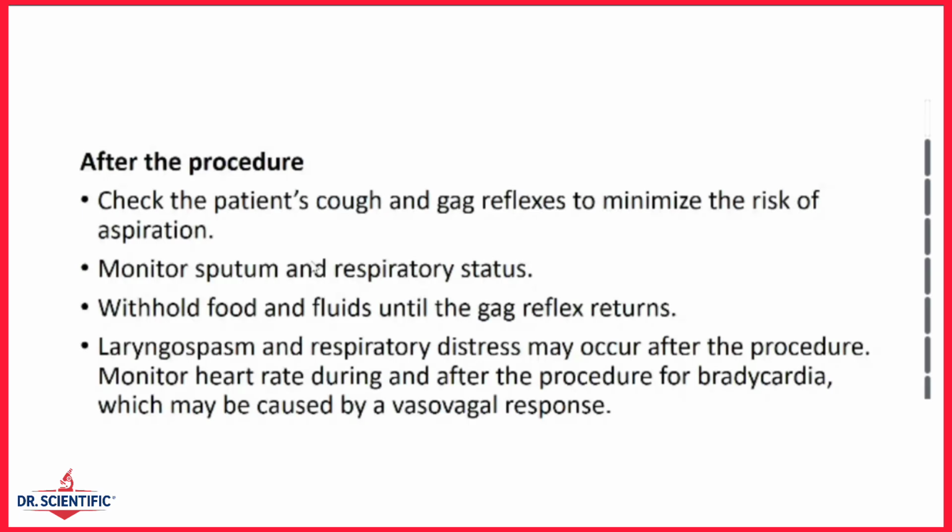Then after the procedure, still maintain the patient nothing by mouth, so no foods, no fluids, until such a time that the gag reflex returns. Usually the gag reflex will return after about 1 to 2 hours after the procedure.